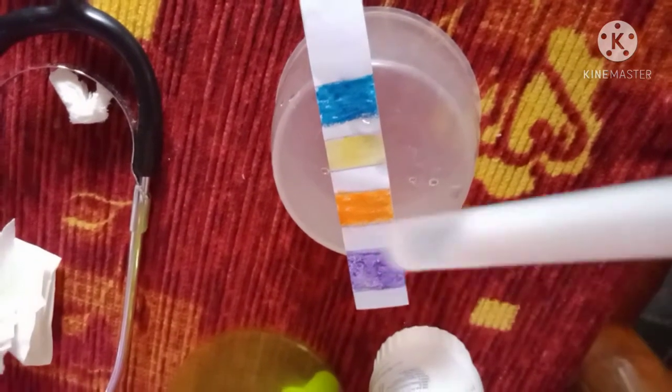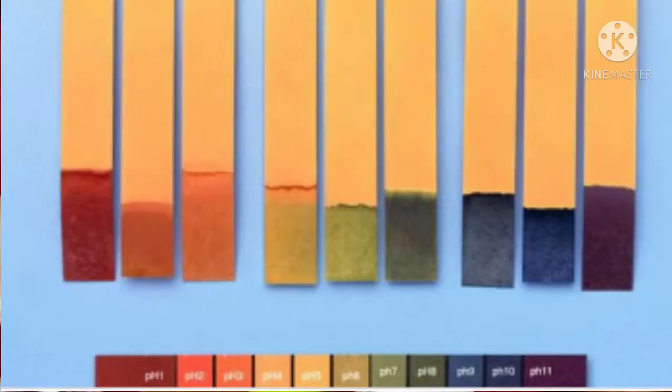Observe for the aspirate's appearance. So, gastric fluid is usually cloudy and grassy green or tan, or off-white in color. In contrast, intestinal fluid is usually deep golden yellow and is clearer than gastric contents.